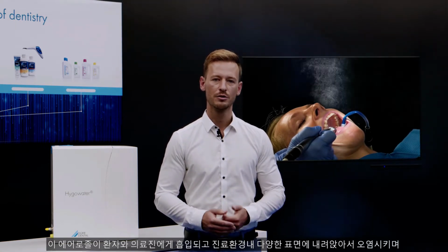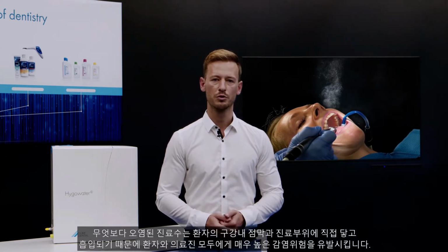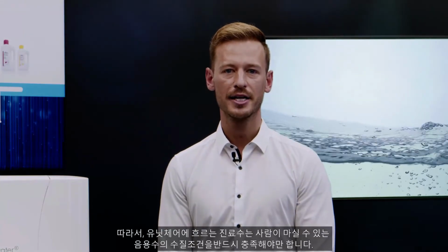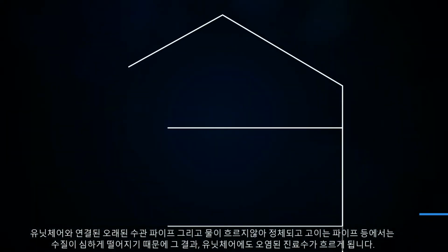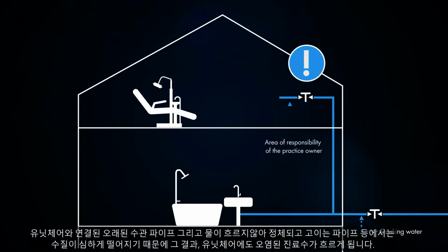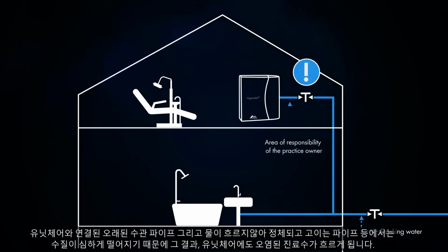In addition, further risk is associated with potential contact with open wounds or mucous membranes, or due to swallowing during treatment. The water that flows into the dental unit must meet the requirements for drinking water quality. Old pipes, pipes that are only rarely used, empty flats in apartment buildings, or so-called dead pipes are potential weak spots that can result in significantly reduced water quality.